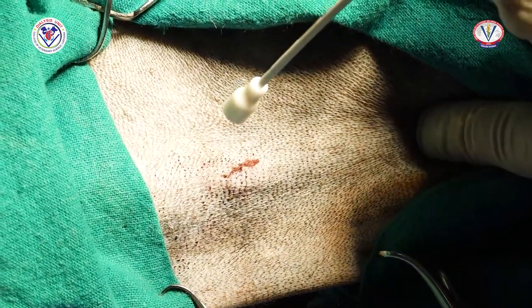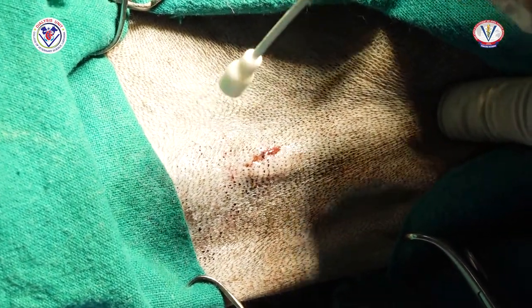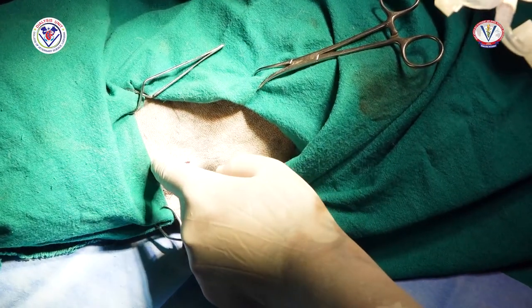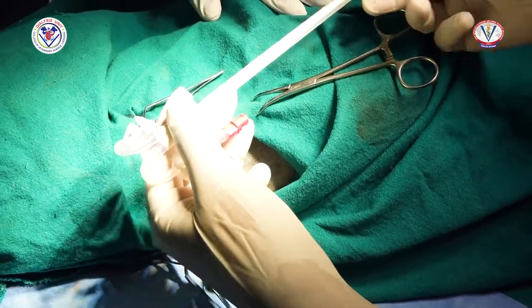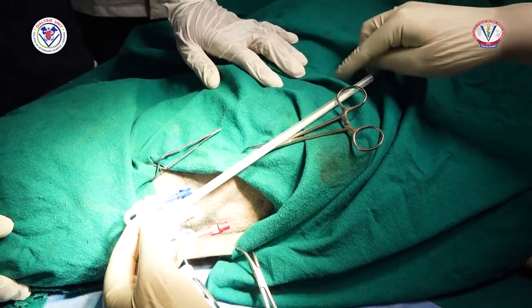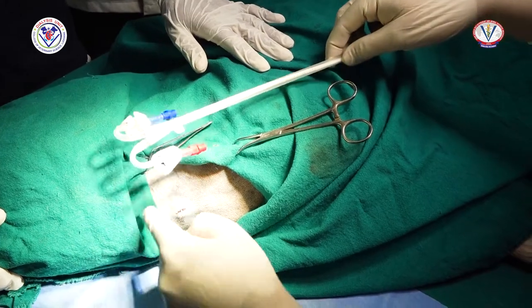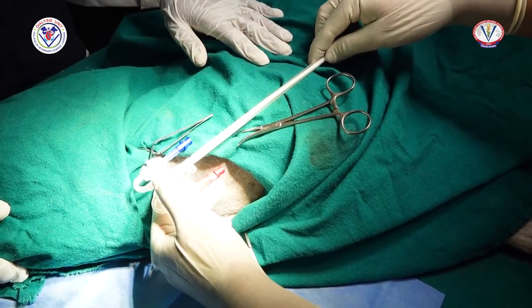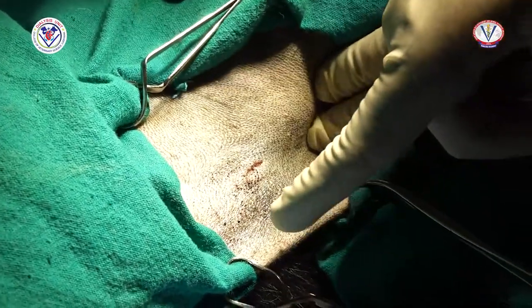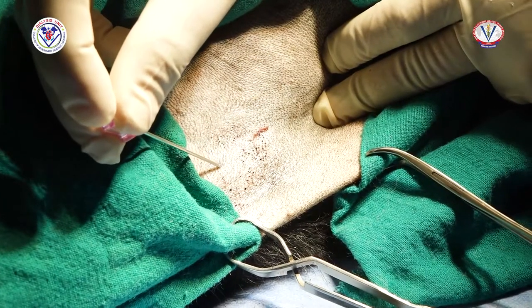Before initiating catheterization, spray local anesthetic to minimize pain. Ideally, the tip of the catheter should be placed at the junction of the cranial vena cava and right atrium. Accordingly, measure the length of insertion site up to the second intercostal space. Raise the jugular vein and insert the needle.